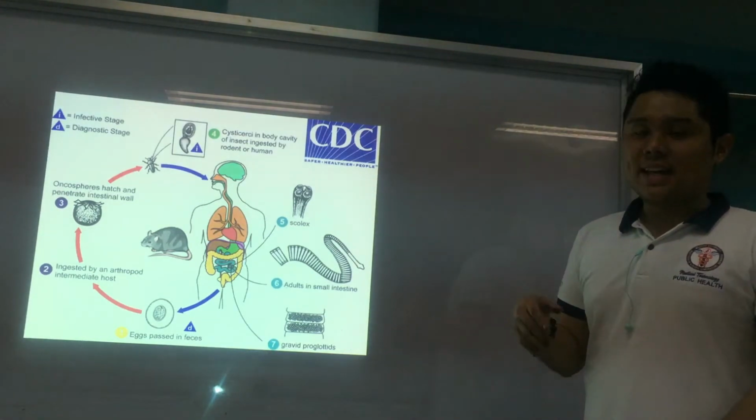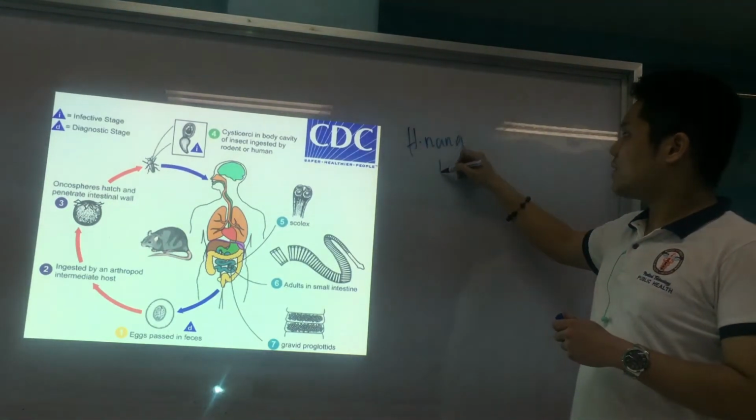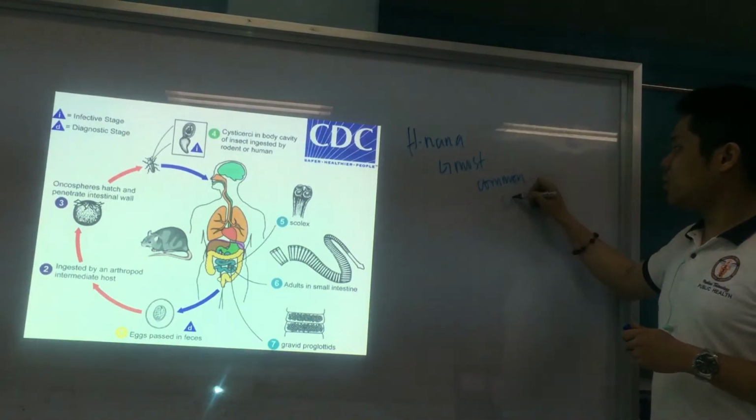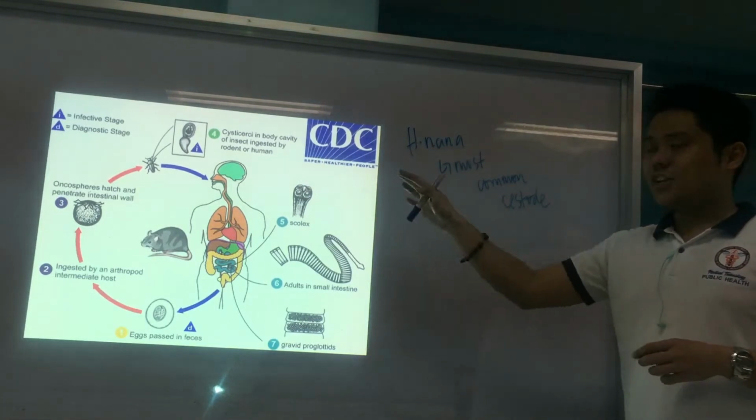But H. nana is considered to be the most common cestode infection worldwide. And H. diminuta.